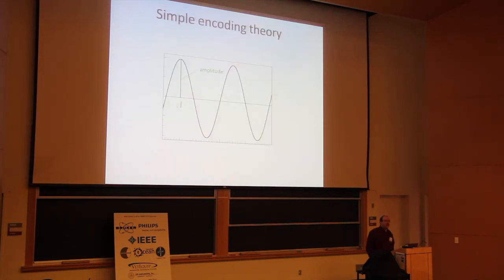So then let's start to encode an MPI image. We have our drive field, some amplitude, and at first we have the first field change of 2XS, and we learned we get that voxel out of it. And then the next 2XS field change, next voxel, and so on. And in the end, we have reached the amplitude, and now we can compute how many voxels we have. It's just A over 2XS.